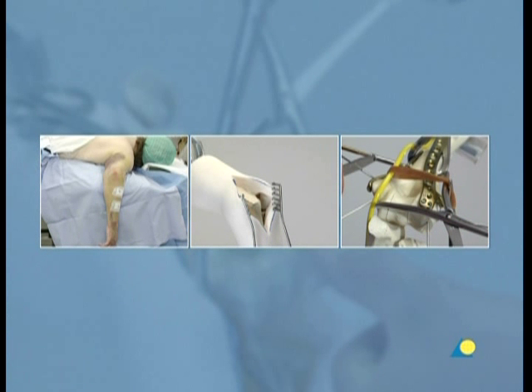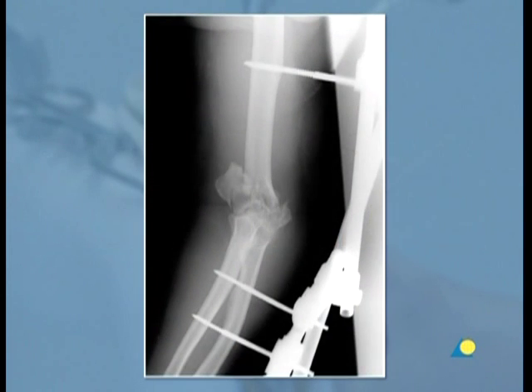Prior knowledge of both the conventional plating techniques and the LCP principle is necessary. This demonstration is based on a clinical case.